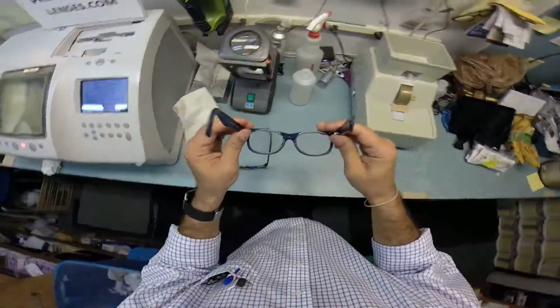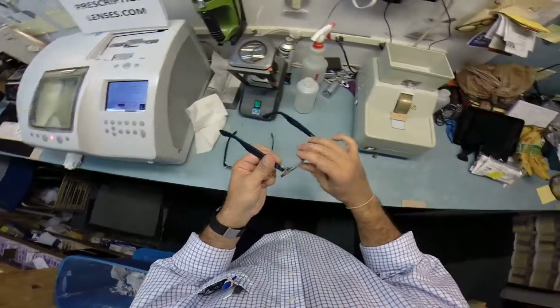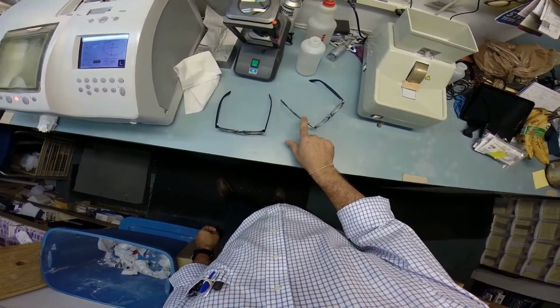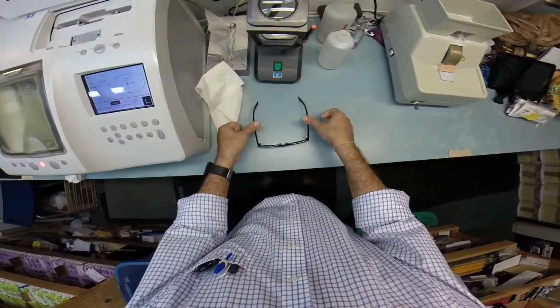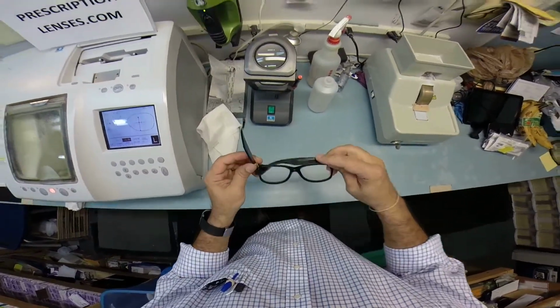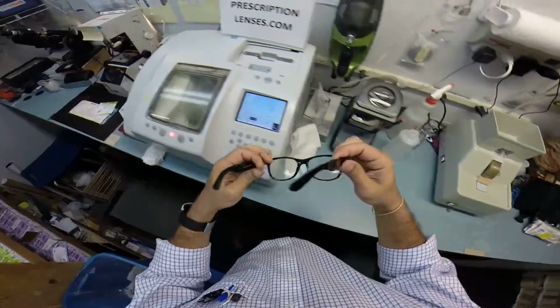When I say wobble, the reason why every optical shop does free adjustments is 80% of people have one ear that's higher than the other. And I'm no different. When I take mine off, they wobble on the counter, but they sit level on me. So again, I press down with both thumbs. There is no wobble. Flip them over. There is no wobble. I close each temple to make sure they overlap perfectly, and they do.